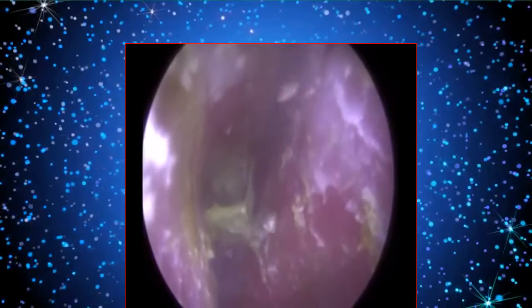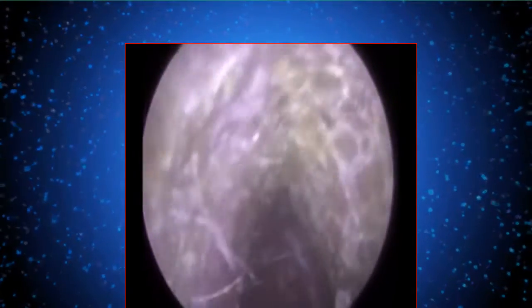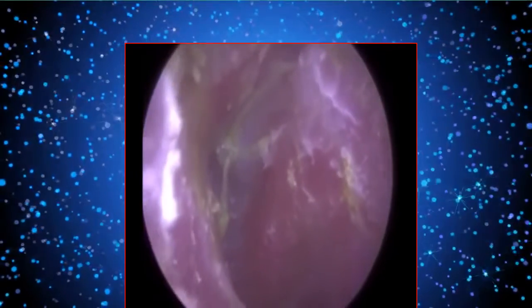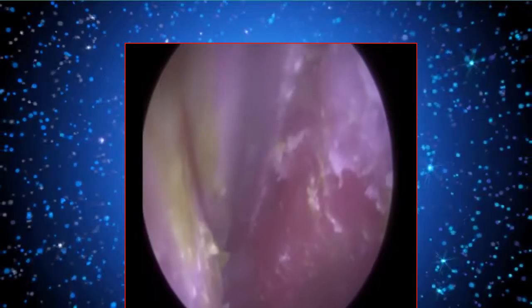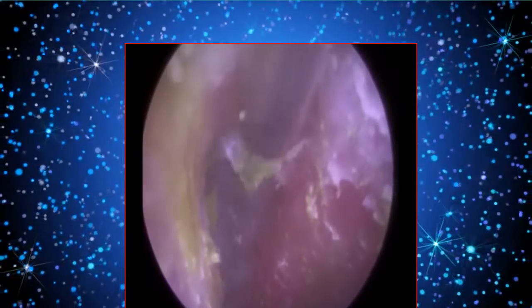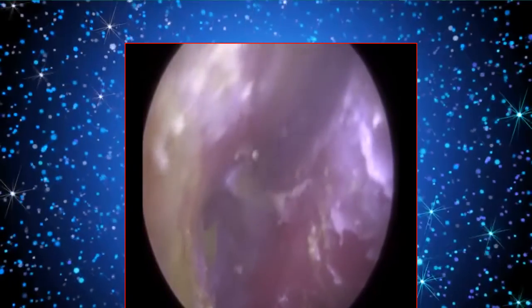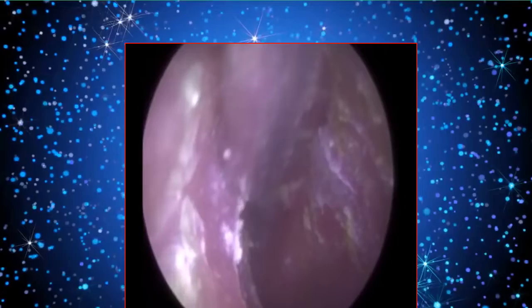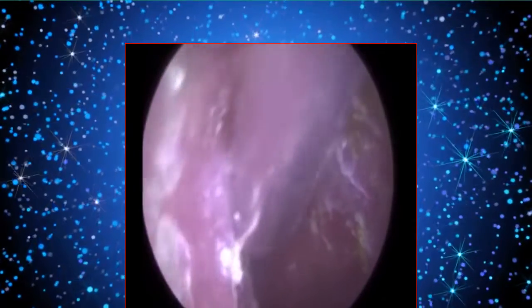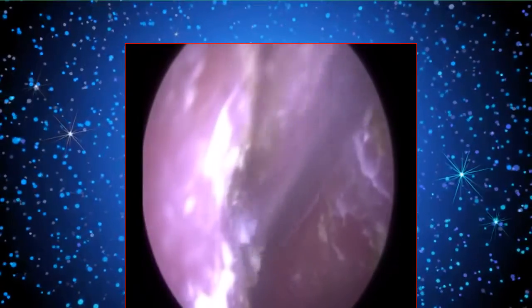It's just going to be really, because I'm going up, I just don't want to go up and into the eardrum and tear it or bruise it or cut it. So yeah, I managed to get that. There's still a bit left there, but again, at this stage I'm quite happy with what we've done, if I'm honest. The patient still can't hear 100% because they've got this middle ear infection as well, but can hear significantly better than when they first attended. I think we've given a good chance for this infection to clear now, because most of the infected debris is out.